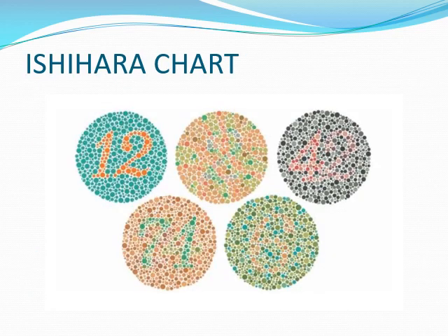This is the Ishihara test, which is useful for red-green anomalies. In this, if the patient is educated, the person is asked to look and find out the number, and sometimes there are even patterns which can be traced by the patient's finger, which helps us know if the patient can differentiate between the colors. Thank you.